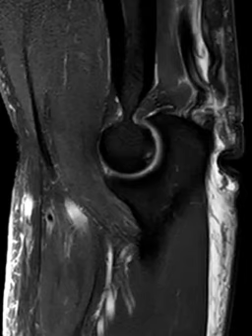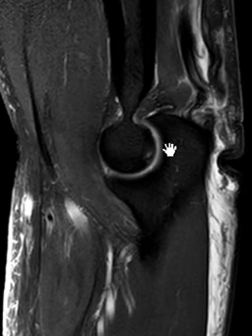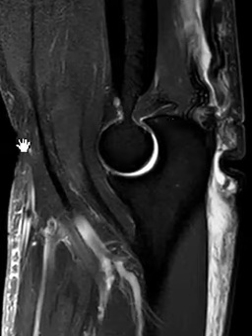This is a 61-year-old male who fell about a week ago and has had posterior elbow pain. The physician suspected a torn triceps tendon, so we have an MRI here of the elbow joint. We're looking at it from the side, so this is a sagittal view.